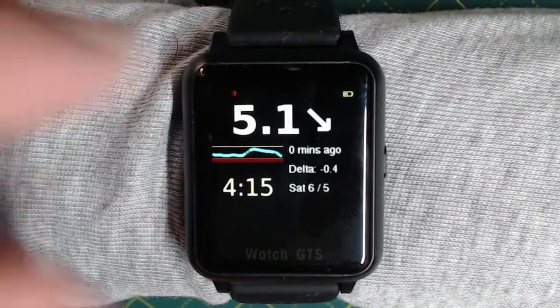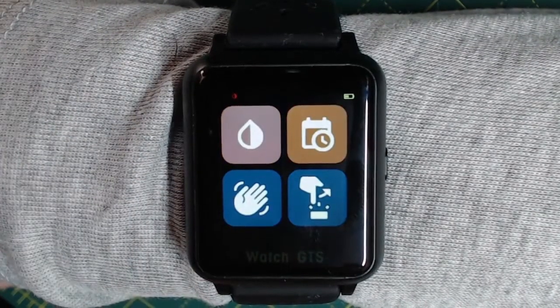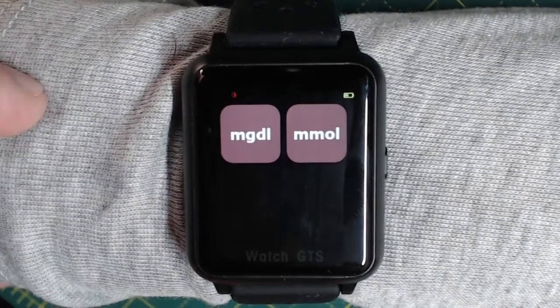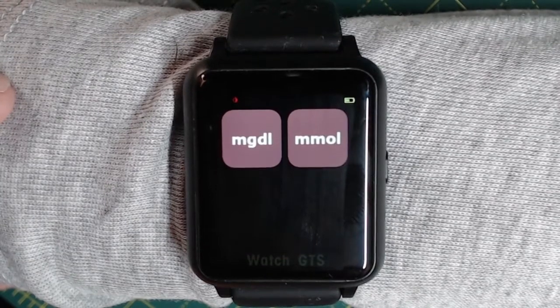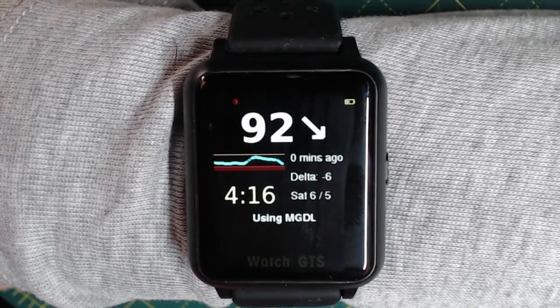Let's go back into settings and have a look at the units or measurement section. Let's go into the Xtrip Core settings. Here you can change from milligrams per deciliter or mmol units of measurement. Let's change it to milligrams per deciliter. So now you can see the display has changed to reflect that.